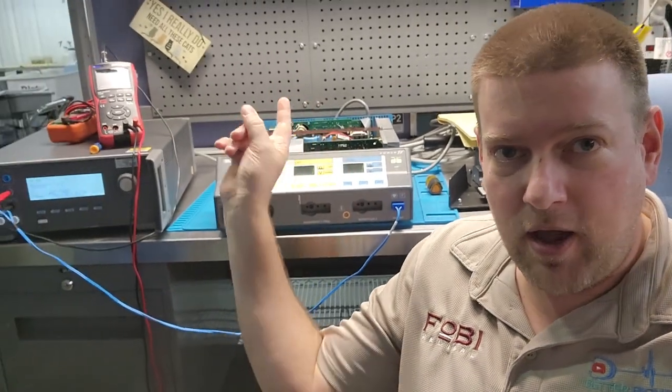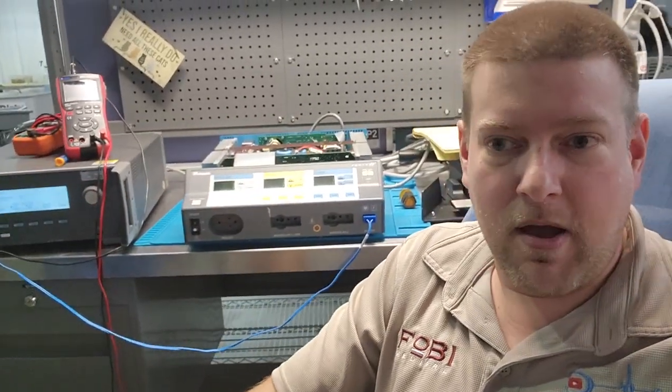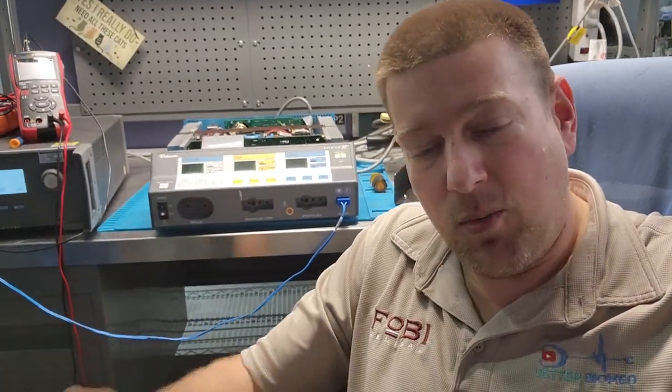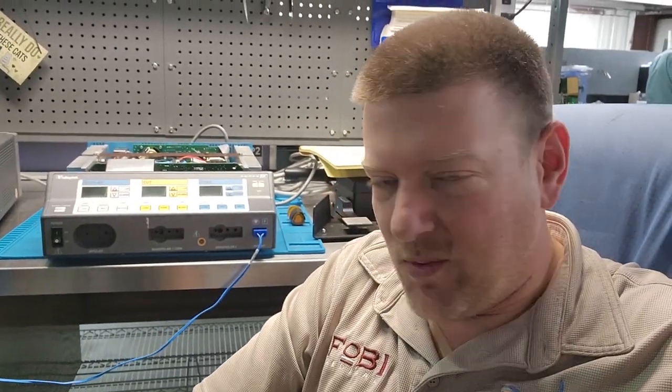However, using an oscilloscope, you have to adjust the waveform just so and then run through your ohms calibration. So let's go ahead and take a look at that right now. Coming up next right here on Better Biomed. I'm so tired.